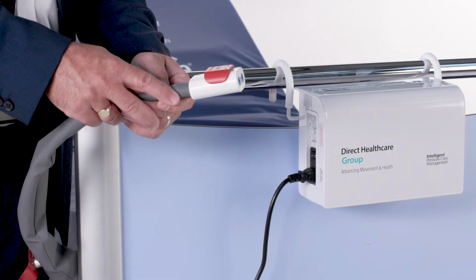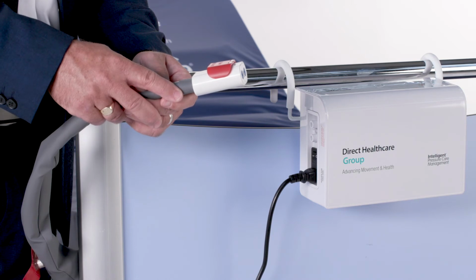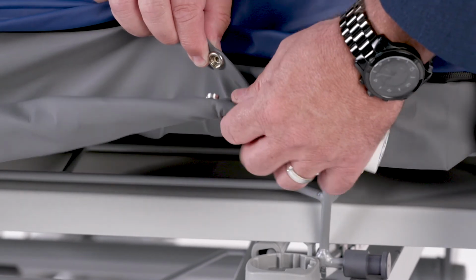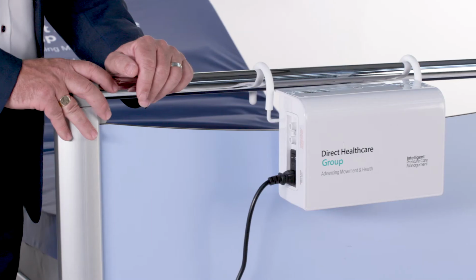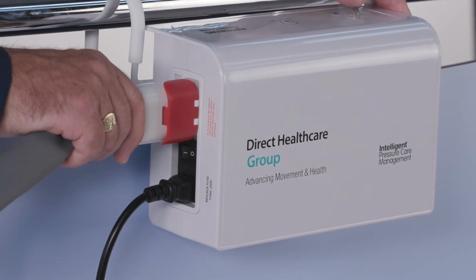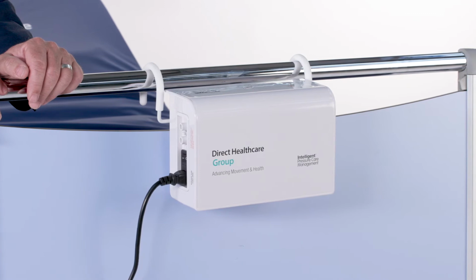When the pump is not in use, safely store the umbilical in such a way that it does not cause a hazard, i.e., please connect the umbilical cord to the popper at the foot end of the mattress. To provide powered alternating therapy to the mattress, the pump must be connected via the umbilical and powered on. The pump can be attached and powered on when a patient is lying on the mattress.